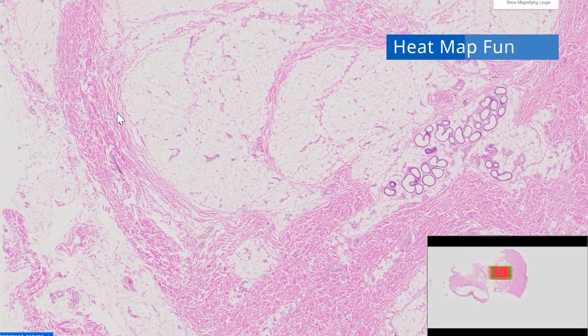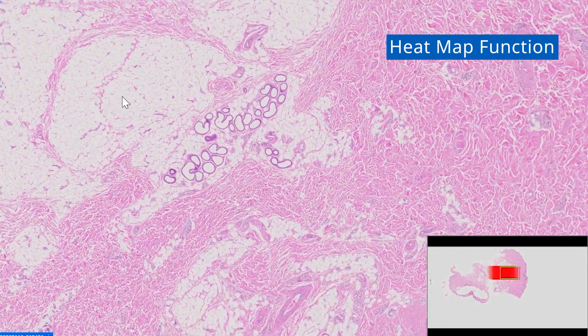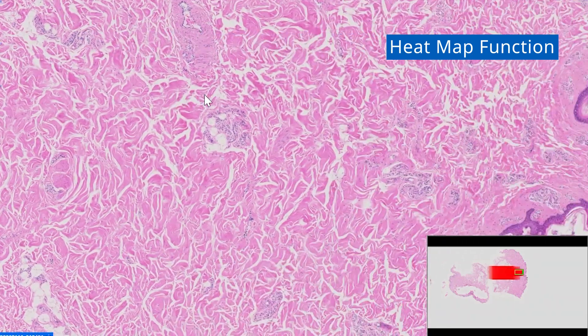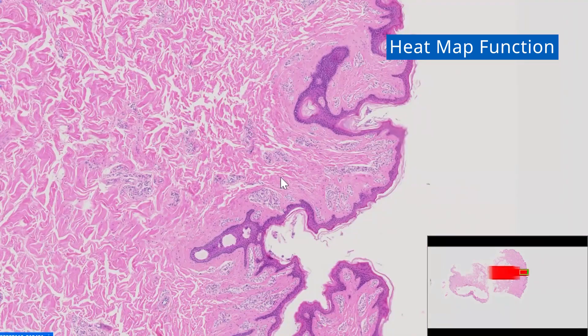You can quickly check which part of the slide you're observing using the heat map window. The system automatically records visited areas for current and future reference.